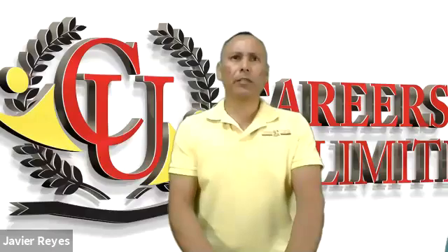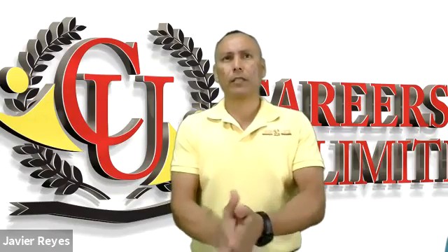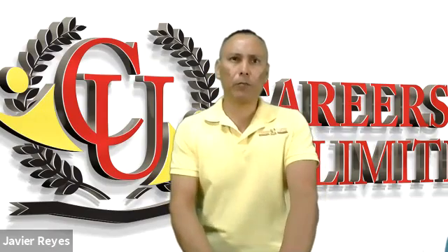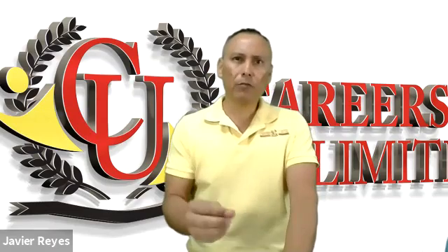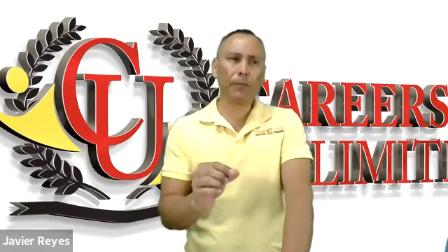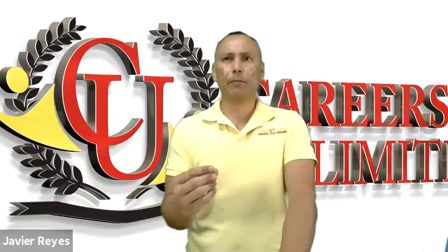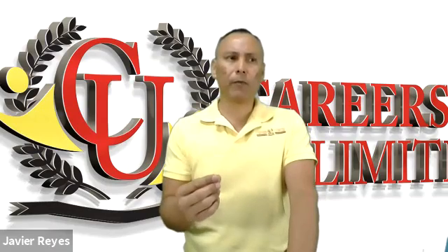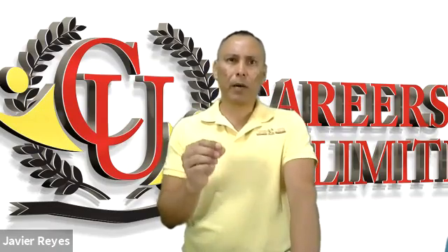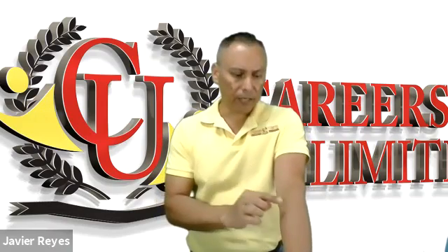Now, other problem areas you may encounter are damaged veins. Damaged veins are those veins that are sclerosed or hardened. How do those feel? When you palpate a vein, remember we're looking for a bouncy sensation. We want to make sure that vein is nice and bouncy and that it's filled with fluid or blood. We don't want to try to collect a specimen from a vein that is hard. So don't get confused. Always look for that bouncy sensation when you're palpating for the veins, right?